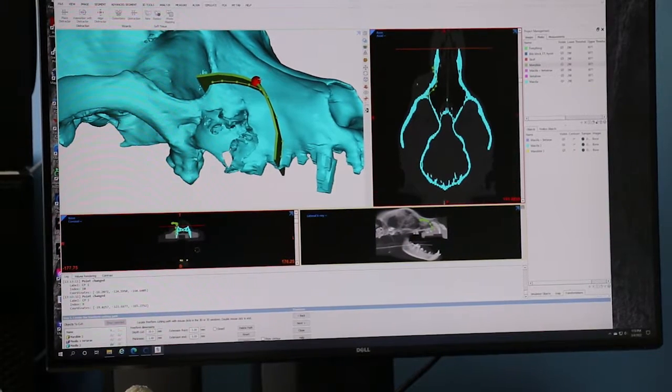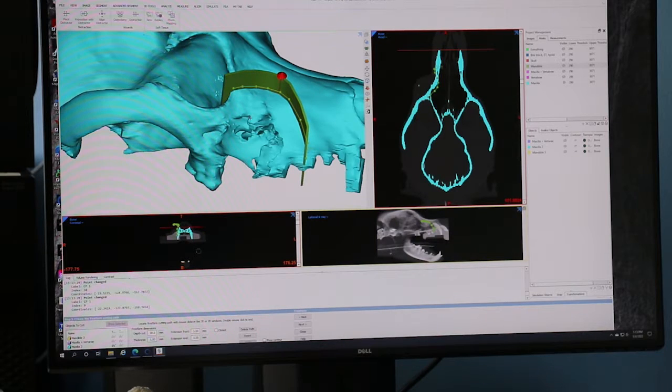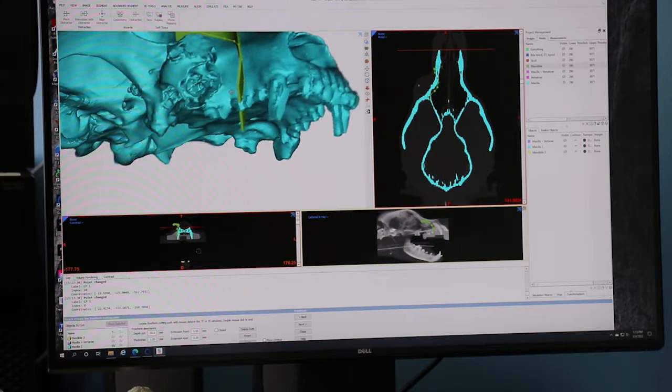An overview of what I do would be to take imaging studies like a CAT scan, CT, into a dedicated software where I can create 3D models of a patient's both head and pathology, the disease process itself. And then I use the three-dimensional models in a virtual environment within the software to perform the surgery, practice the surgery. And from there, I can print 3D models. And all of that is all to speed up the surgical procedure itself, rehearse it, and minimize complications.